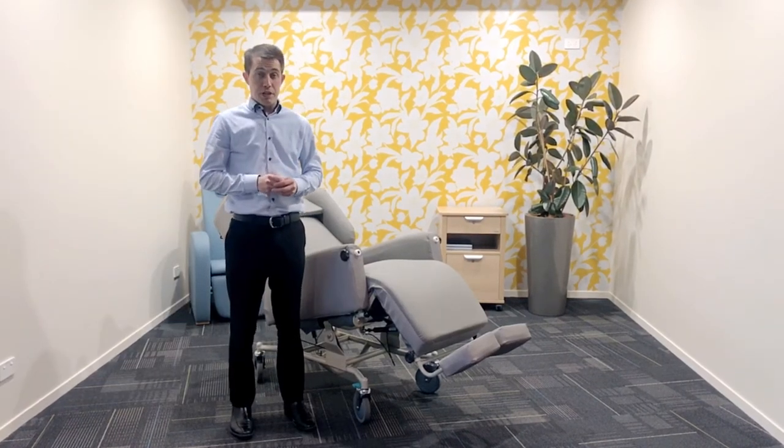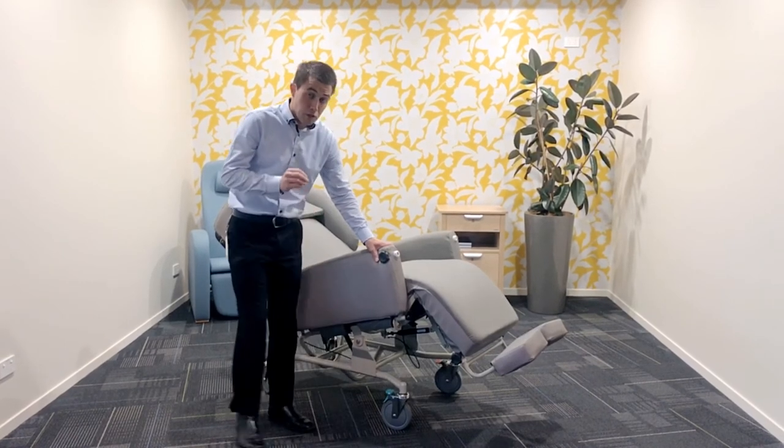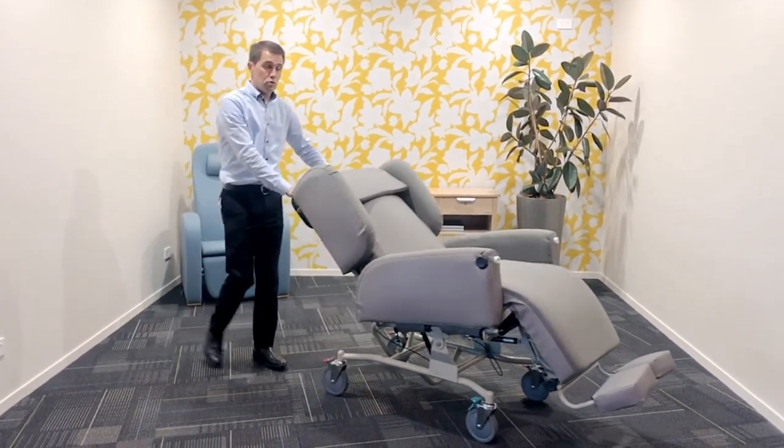Another great benefit of this chair is the track lock. This green lever is not a brake. What that does is holds that wheel straight, so it is much easier, with the resident in, to push them straight down a hallway.